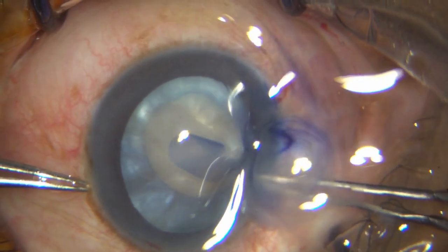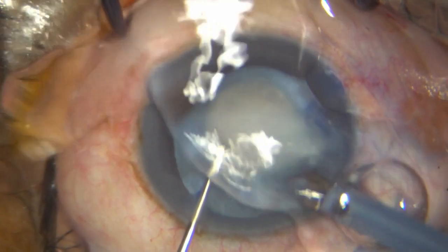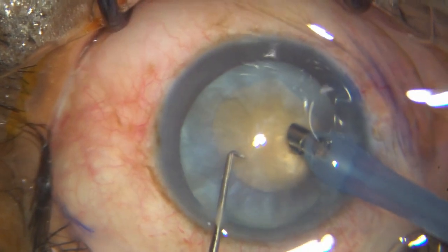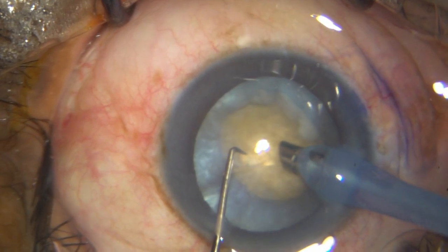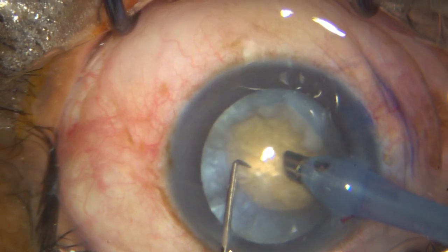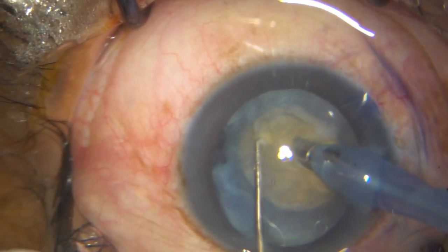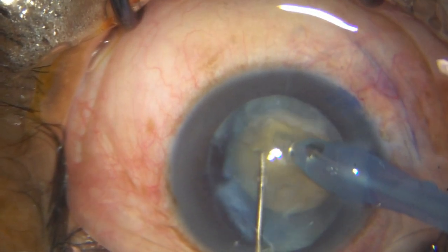And you do not need any hydrodissection in this case. Take my sharp chopper in my left hand and the Phaco in the right, and you can see the nucleus is pretty hard. So I'm at 80% power, 400 millimeters of vacuum, 40 ml flow rate, and I am in continuous mode. So this is my preferred method of nuclear disassembly using this Woodcutter's chopping technique, and look, it works beautifully.